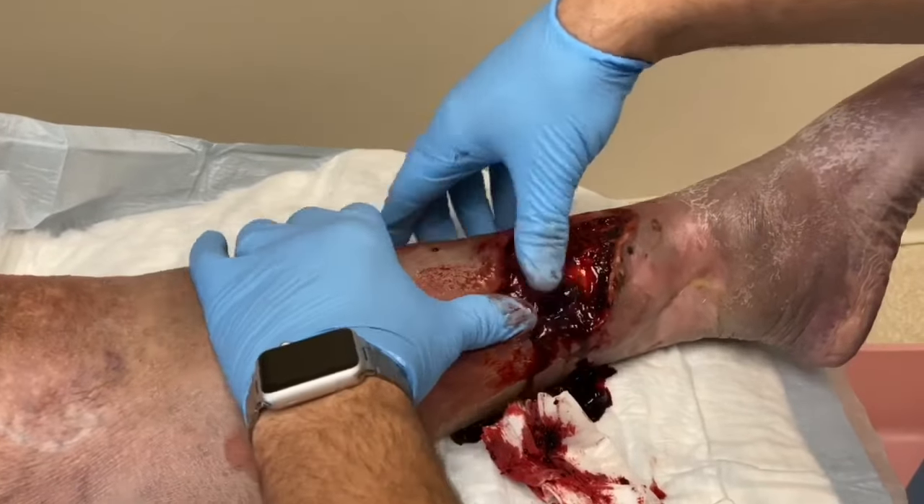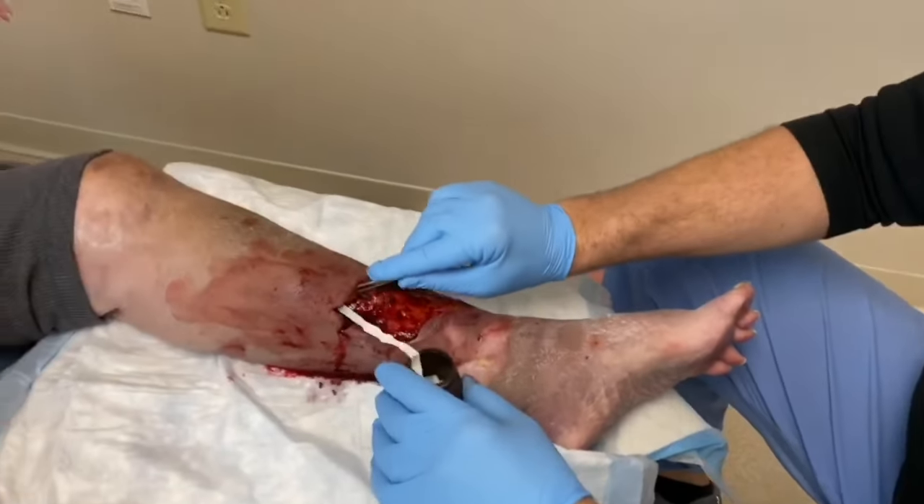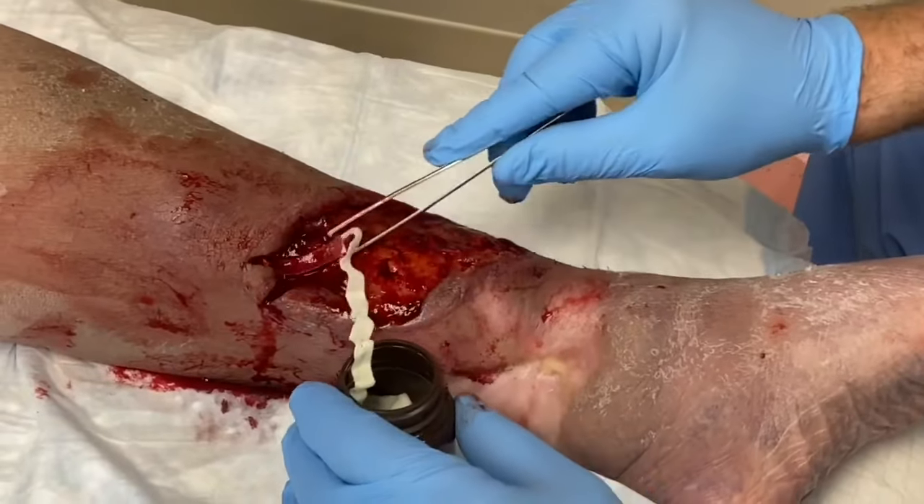Then we're going to pack the dead space with iodoform, which is gauze that's impregnated with betadine solution. This helps to prevent any further accumulation of a hematoma.